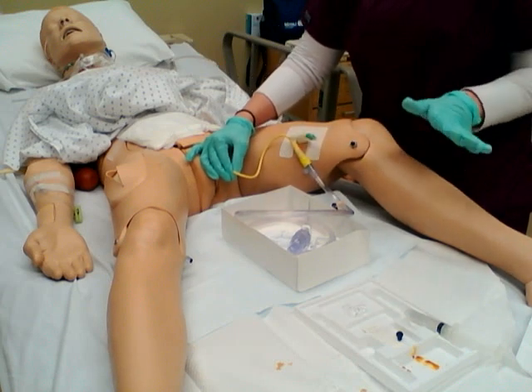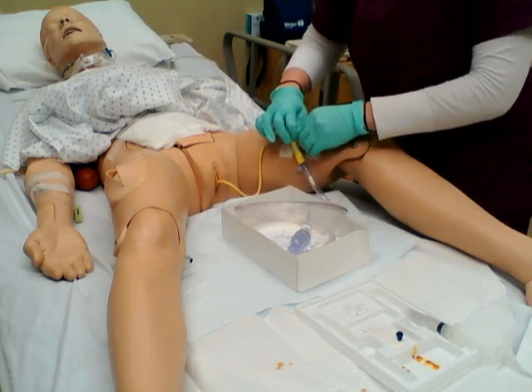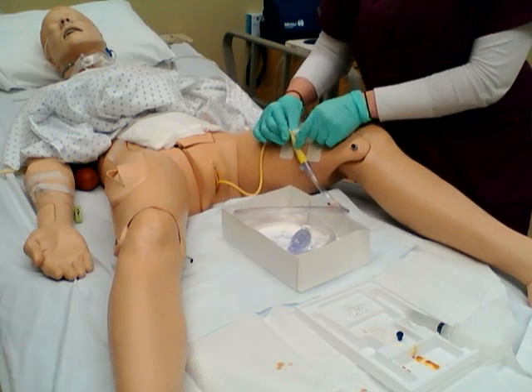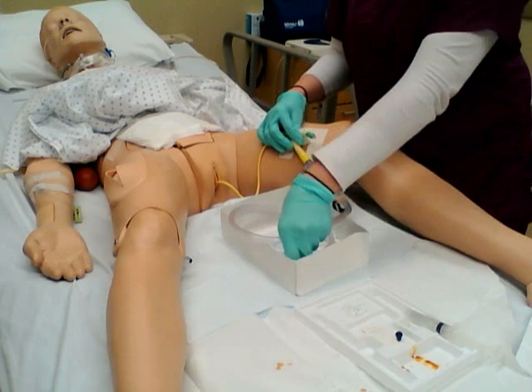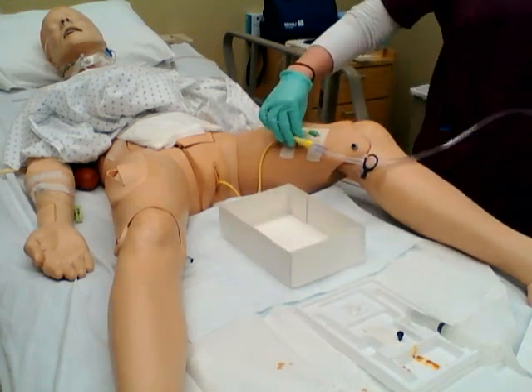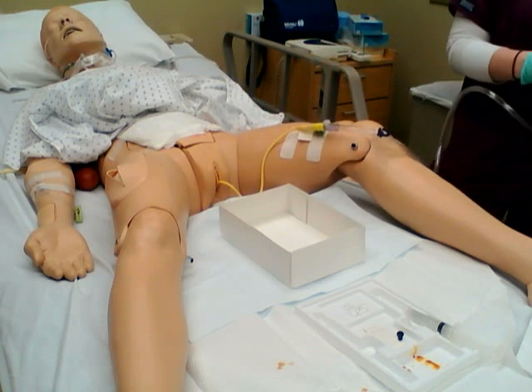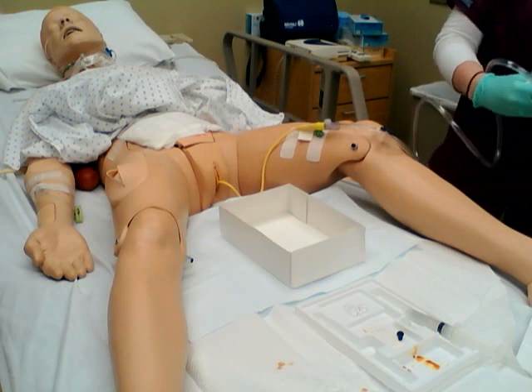So once the balloon is there and filled, you would properly attach this to the leg with this right where it bows off there. And then take this out and hang it on a non-movable portion of the bed for the catheter to be drained correctly and not get tugged on at all.